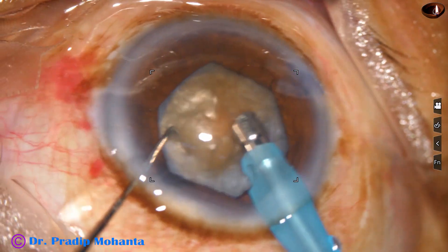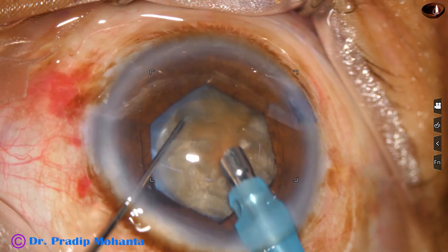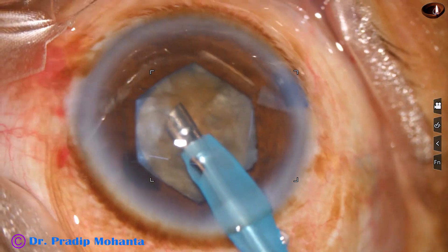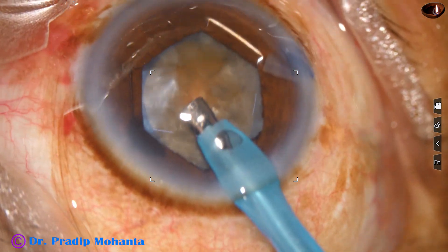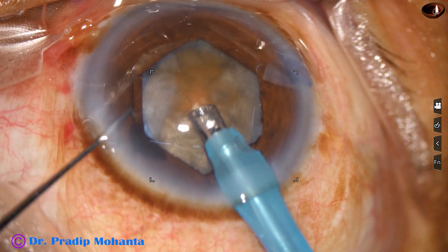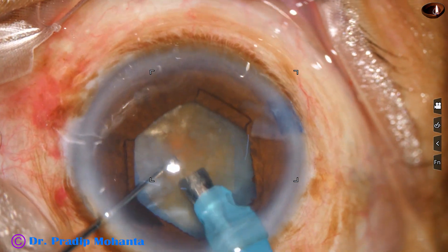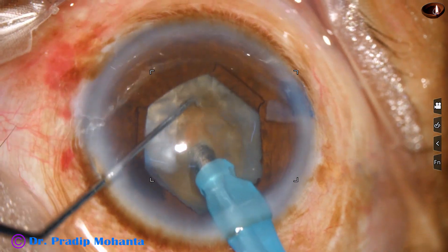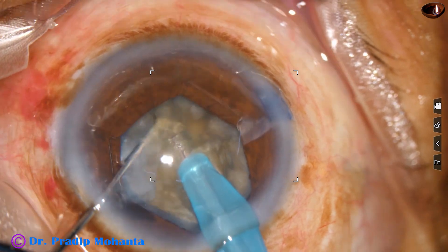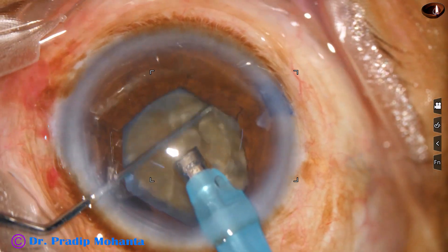Now I am going to manage the nucleus by direct chop. See the exposed part of the phaco needle — it is quite a bit more than in routine cases because I want to deliver more ultrasonic energy into the substance of the nucleus. Here goes my technique, which I call a submarine chop. The tip goes into the substance of the nucleus, travels through the substance towards the opposite equator, and the nucleus is chopped.